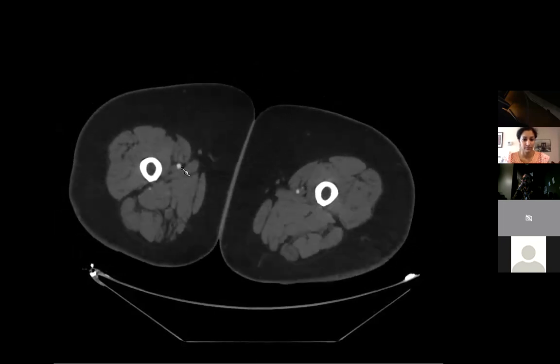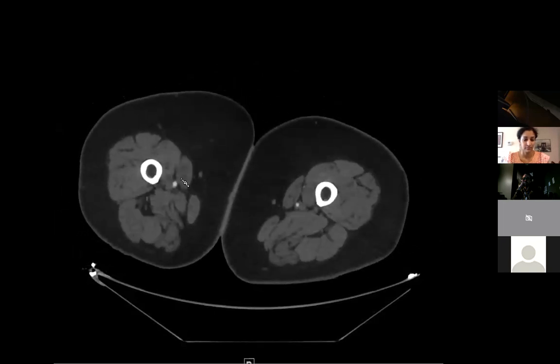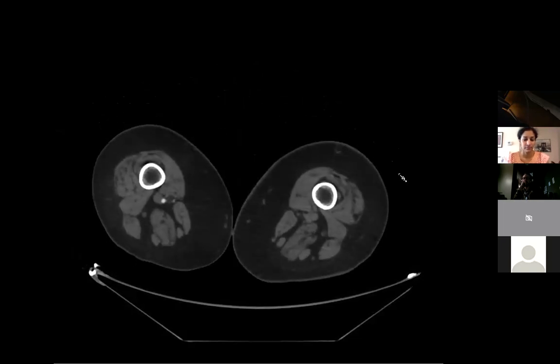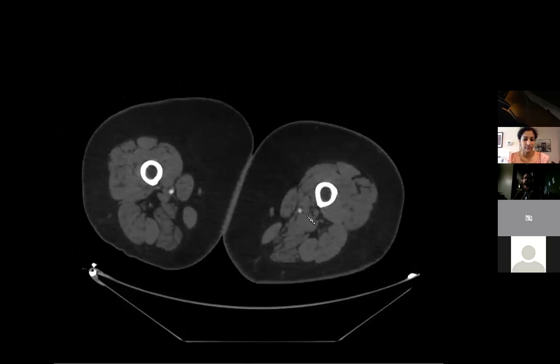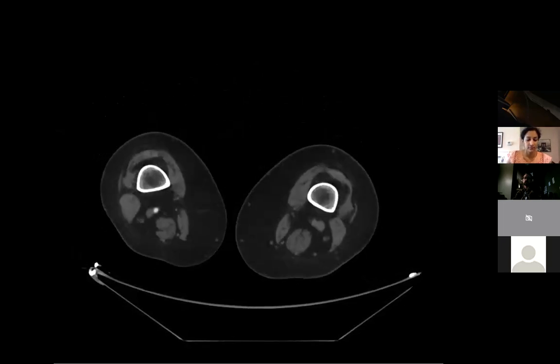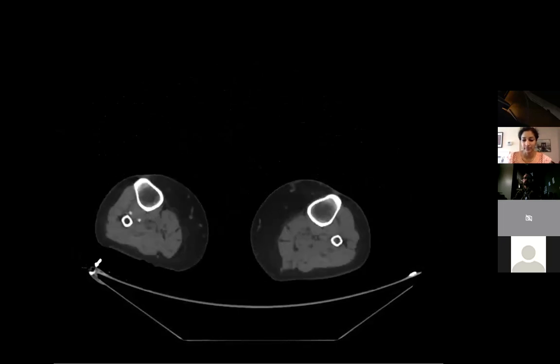Notice how there's really not much in terms of, this is not a vasculopathic-appearing patient. This patient has pretty normal vessels actually, which is unusual for our patient population. But notice how at the level of the distal popliteal on the left, there's just no vascular flow anymore. So her entire left extremity is completely devascularized.